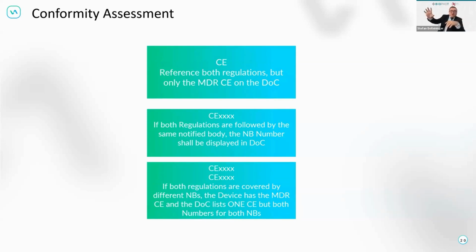So looking long term, choose a notified body who can do both. That's an important step you should go for, and you should really look into the future. So very important to have that, especially since the digital omnibus for the future does not consider that in addition. Not yet. There will be a mechanism called out, but it's not yet available, so be very precise about what you want to do in the next few years.